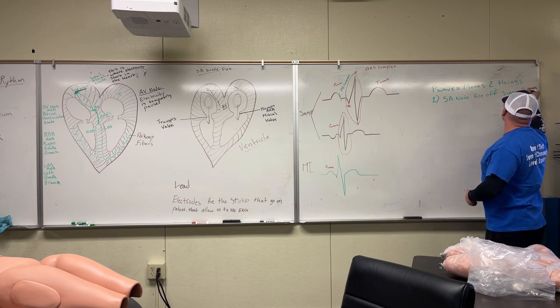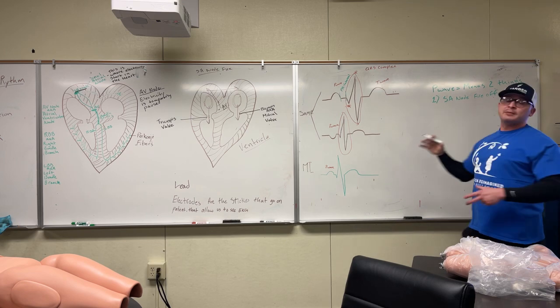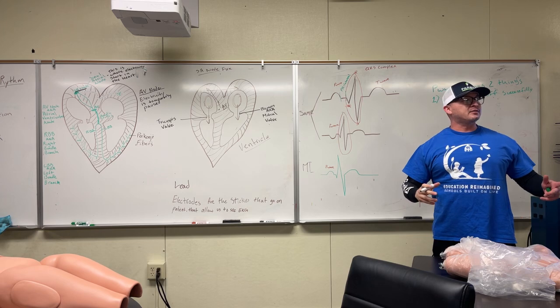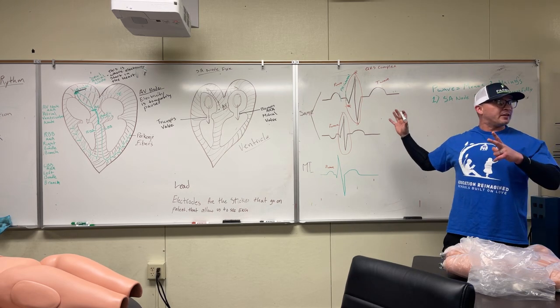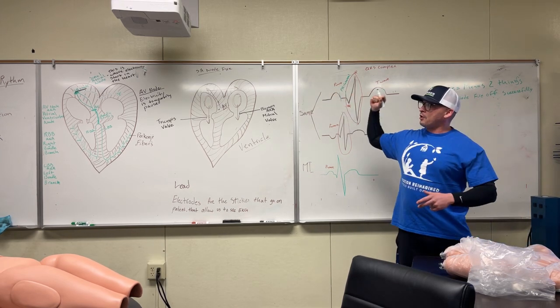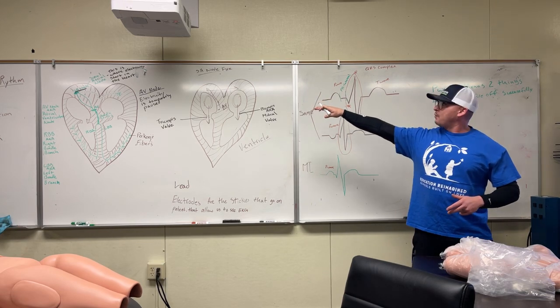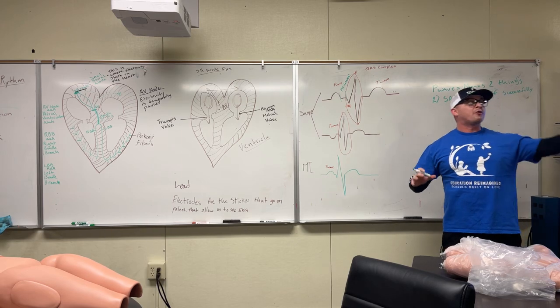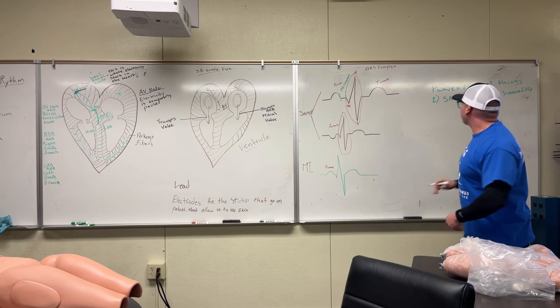What if it's upside down? Well, that's something that we're gonna get into probably tomorrow or the next time I see you guys. Right now I just want to cover what a normal conduction system working right and what the contraction looks like on an EKG. Once we get the normal stuff down, then we'll go over issues. Okay?